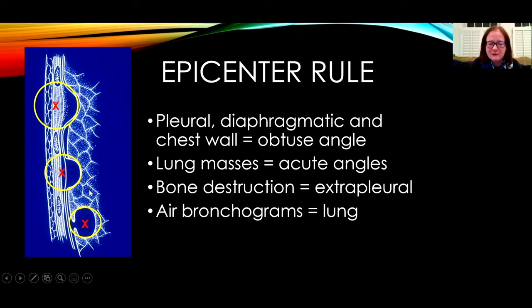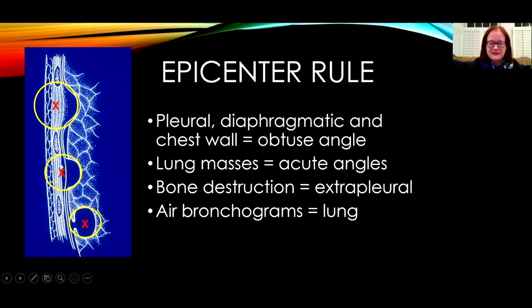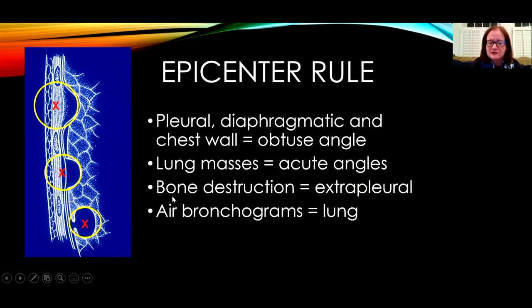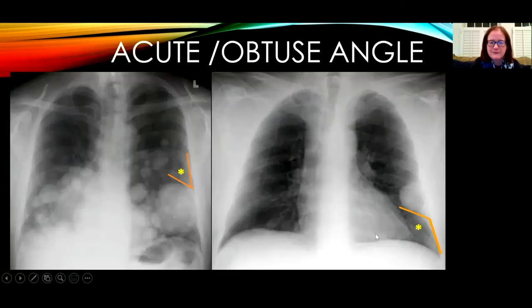Unfortunately, we often end up with a lesion that makes a 90-degree angle with the chest wall. In that situation, if there are multiple lesions I would try to characterize those, or I would look for features such as bone destruction or the presence of air bronchograms.